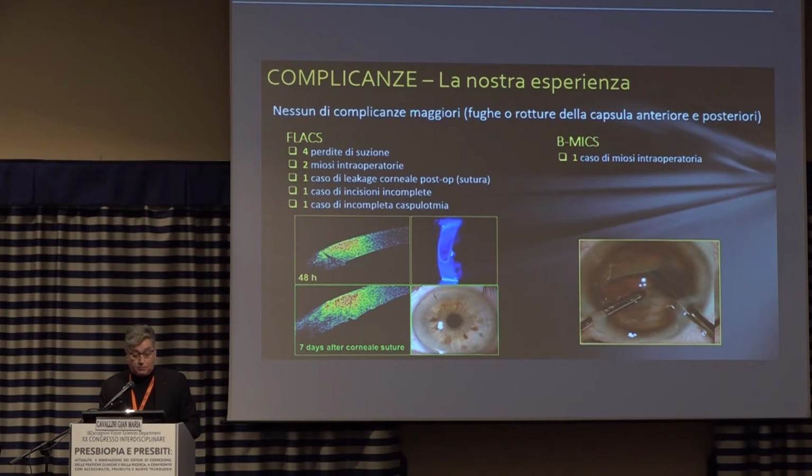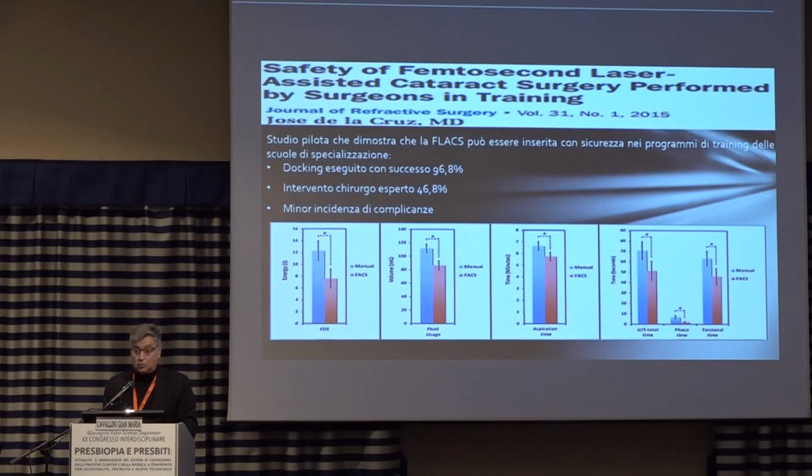Well, severe complications are, for example, opening or perforation of the capsule posteriorly. I've only had this incisional alteration on day 1 at the site of laser incision. Well, this was a monoplanar incision. I do them biplanar now, so I've less risks.